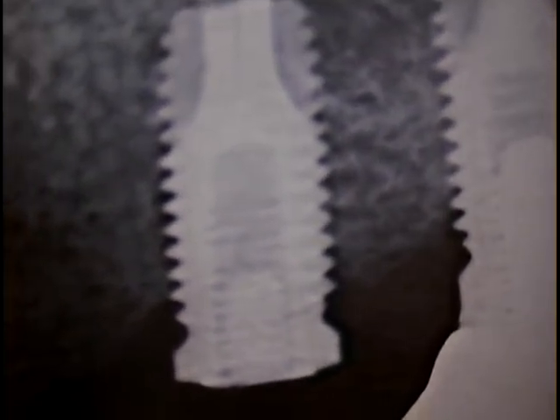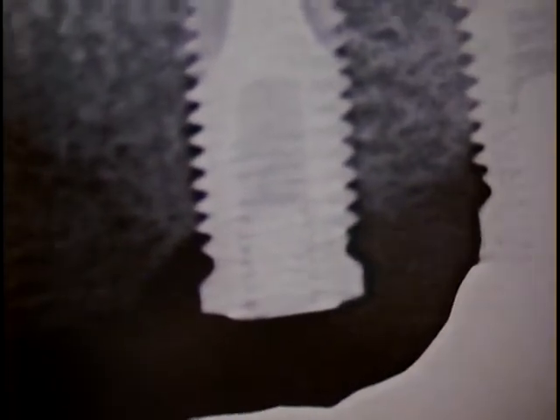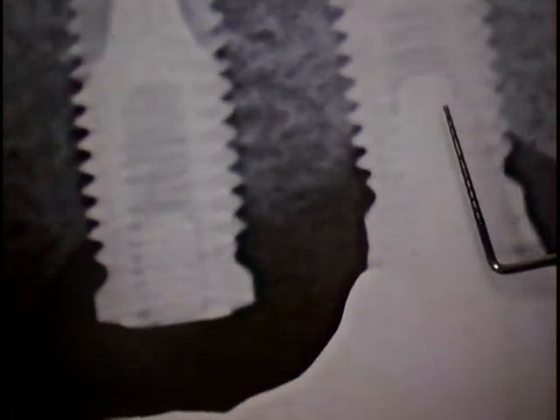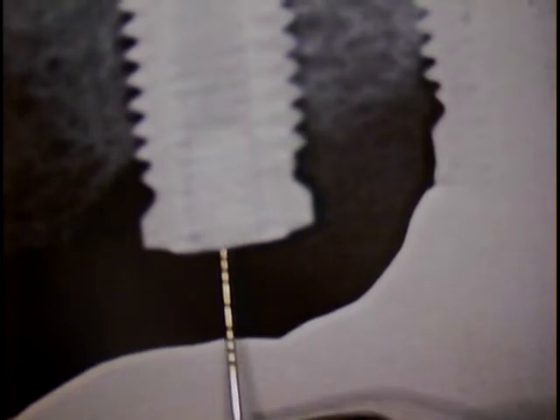We have a screw fragment located right in this zone here. We're probably measuring that about two millimeters in length. It looks like the bottom half of the screw. Most of the Biomet 3i screws have a long shaft that comes from the threaded portion. That area is where we normally see fractures occur, so it must have been a loose implant or abutment, and then the fracture occurred.